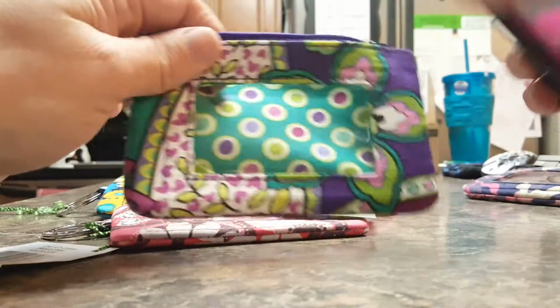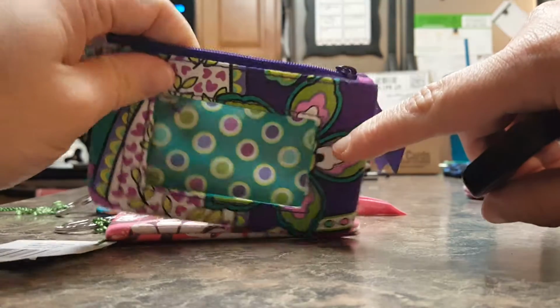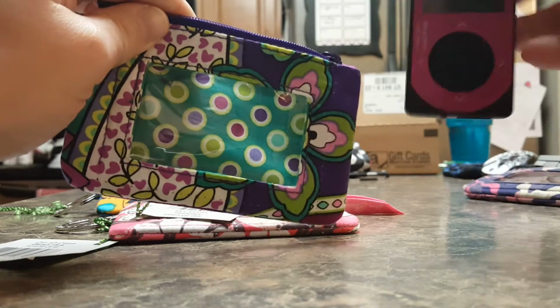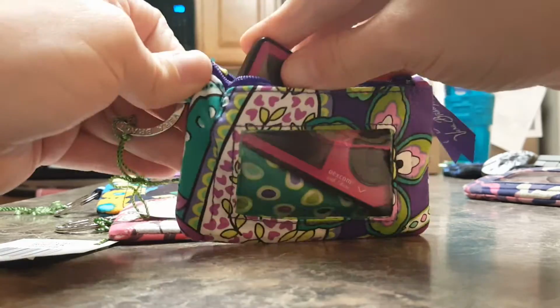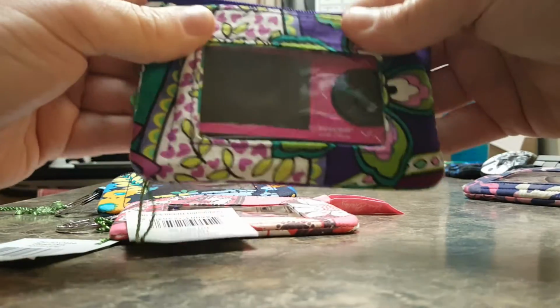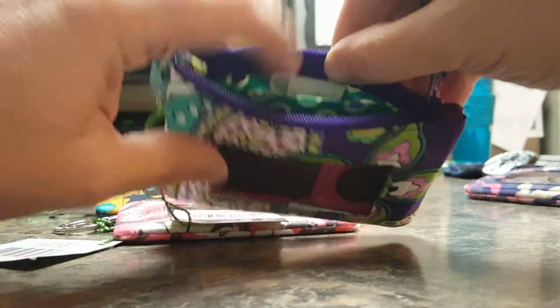When you take out the one seam, I found it's best, I like to take it out on the side where the zipper is when it's open. I'm not sure if that's best. That's how I've done it, and it's pretty easy. You put in one corner first, and then the other. You have to work it in just a little bit, but once it's in there, it's really secure. It stays put. It's not moving around like the other one.